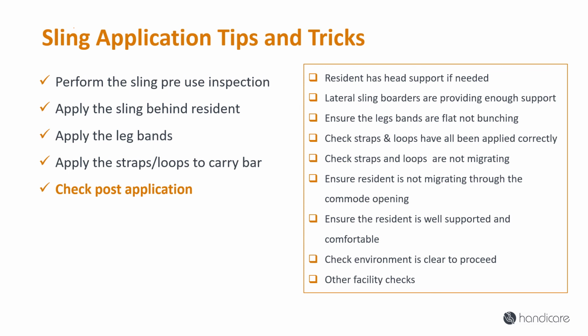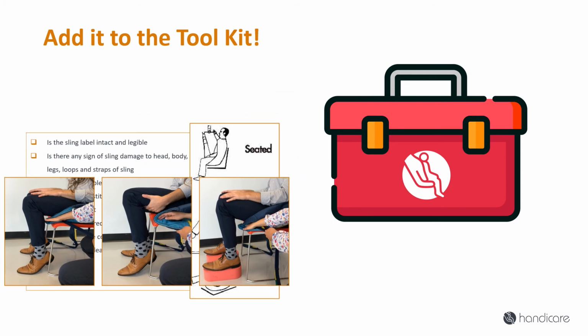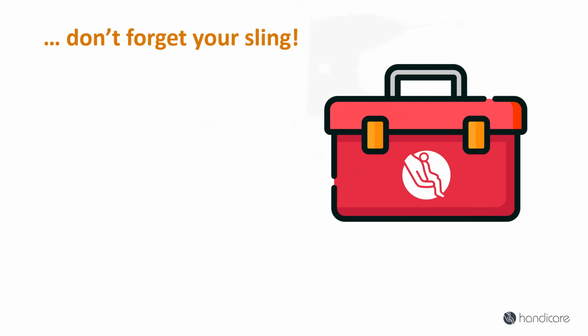For further assistance with sling application, sling user manuals are available on the Handicare website. Add it to the toolkit. Lastly, don't forget to add a sling to your toolkit that can be used specifically for training purposes. Now you're set to cross-train staff in safe client handling.